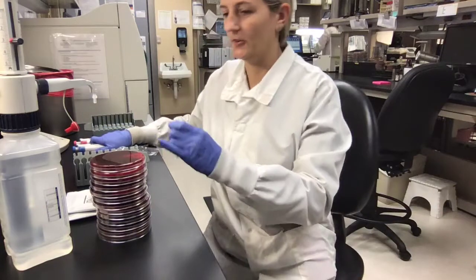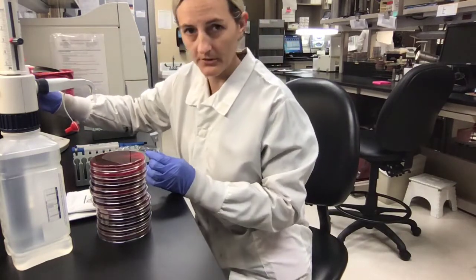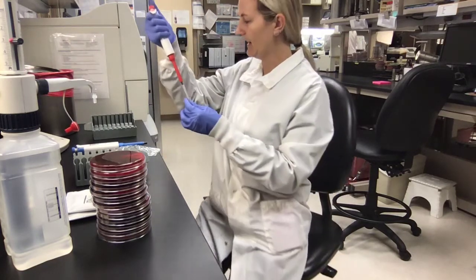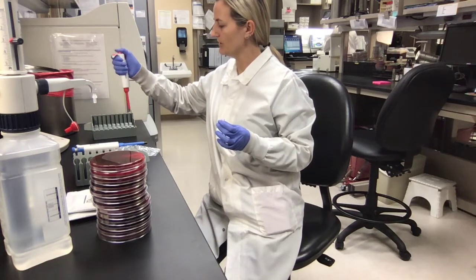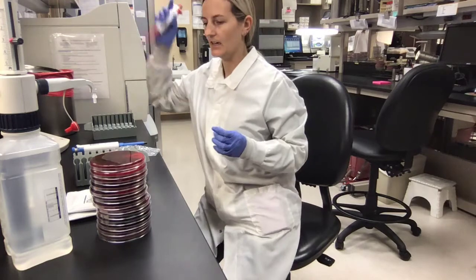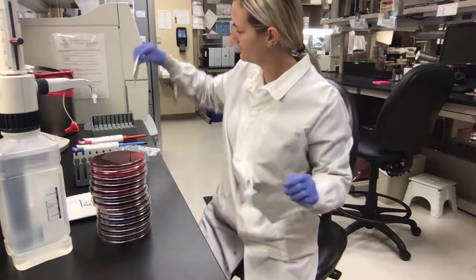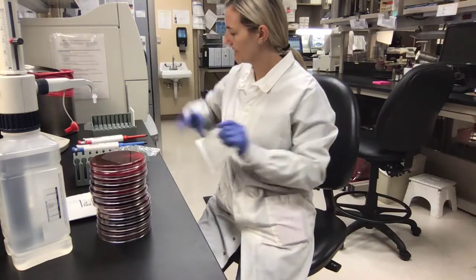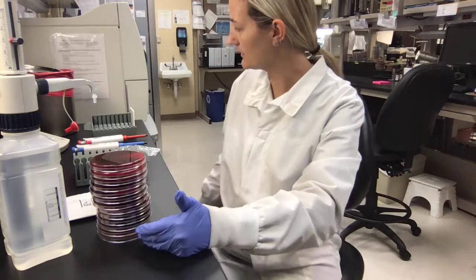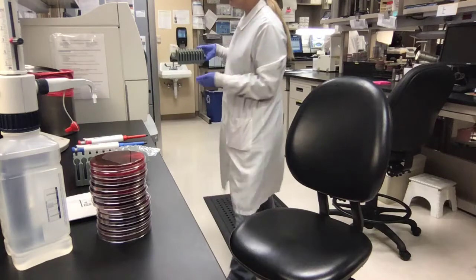Since it is a gram negative — I took E. coli — I'm going to use my gram negative pipette because they will be two different volumes. I take a little bit and put it over here to make my dilution, mix it a little bit, then go ahead and add the card. Once I repeat all those steps for the remaining 12 organisms, I will go ahead and load this into the Vitek.